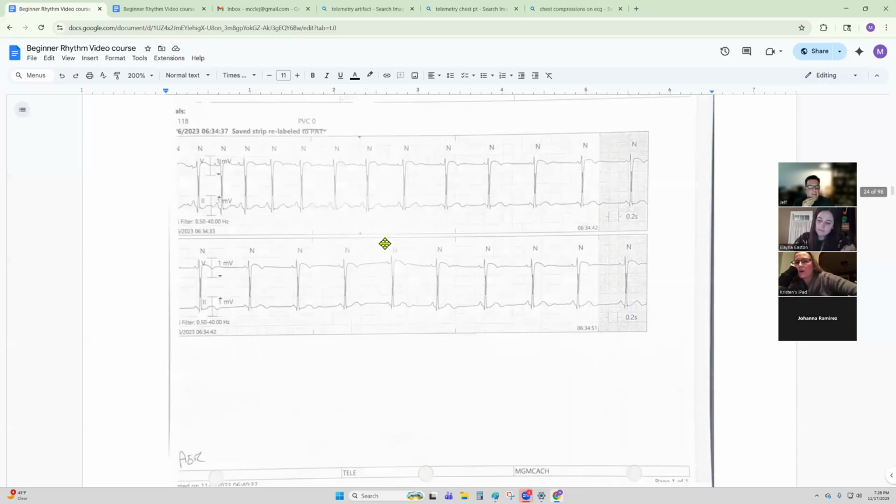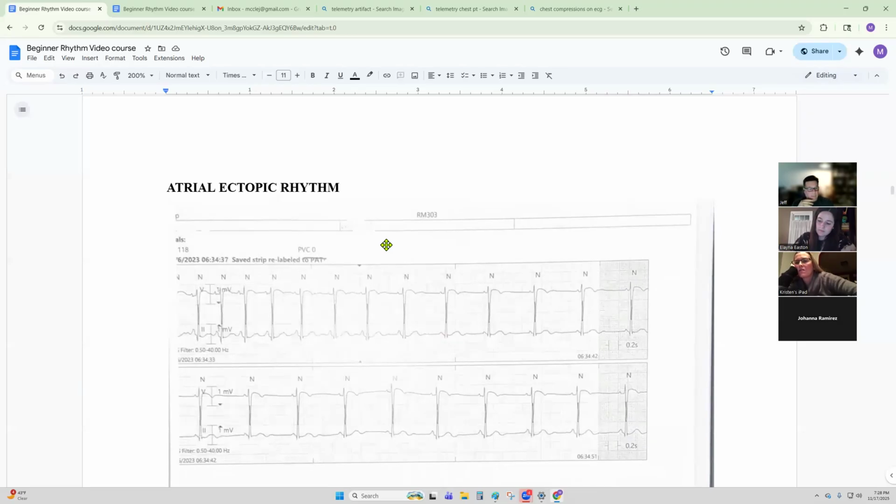Okay. So is there any... it's just a sinus exit block. It's not really something a lot of times. What would it indicate? A lot of times it's increased vagal tone. Whatever they're doing, remember those times where people are vomiting and they go into secondary blocks like that. It's kind of like that. Or they slow down. It's just that increased vagal tone that happens. And there are things, medications, things like that. But for this Zoom, we don't need to know that.